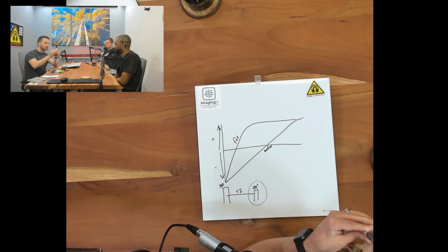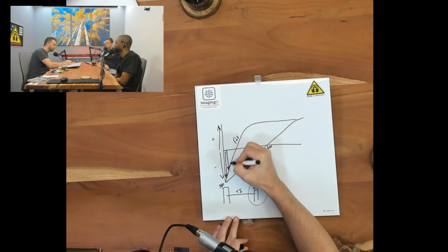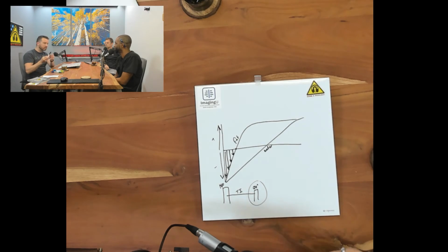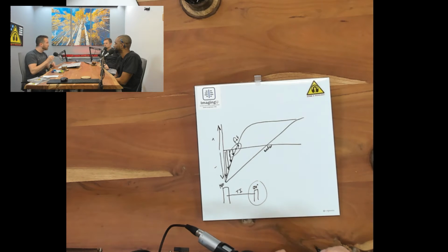Because what's really going to happen here is we give a 180-degree pulse, so we flip it. But then this starts to die, like it starts to drop. And so that's what you're seeing here: the net magnetization vector of fat is getting smaller and smaller. And at some point, it's actually going to have zero longitudinal magnetization. It stops and then it starts to regrow in the positive direction. But if I hit it at or near that null point right there, when I hit the 90, it doesn't get to play the game of MRI.